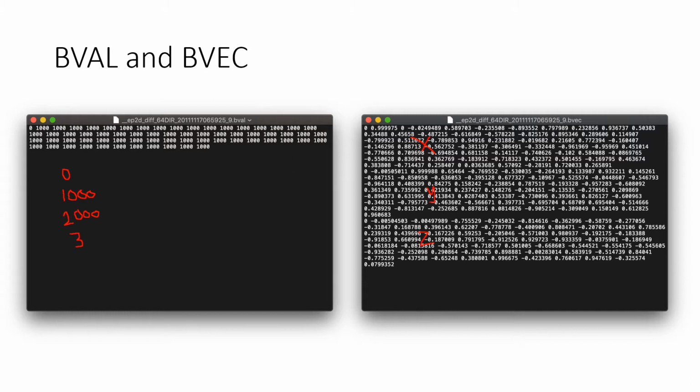And we won't get into all of this. It's not important for our class. I don't really deal with these in any of my research, but both of these files are important because they tell the software that we'll use how the data were acquired and how the directions are applied, so we'll be dealing with these at least as inputs to our processing.